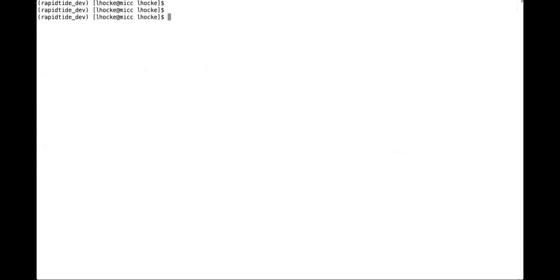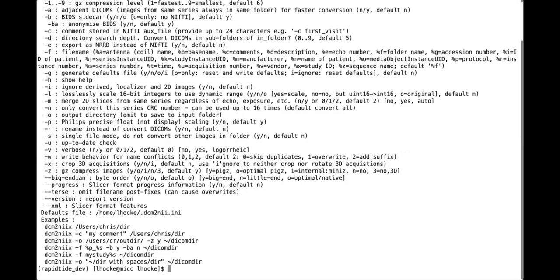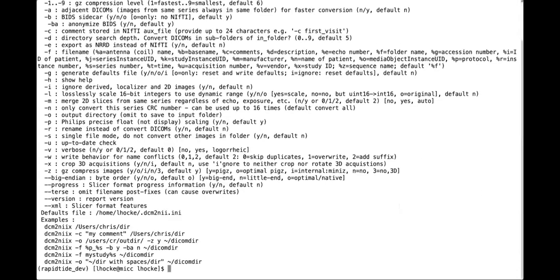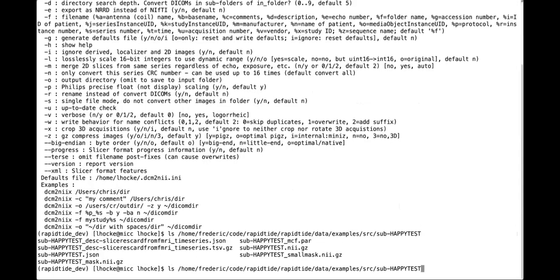If you wonder how to get to that data, you normally just have any DICOM files, and if you do dcm2niix, you will directly get the JSON file as well as the NIFTI file, and everything you need will be stored in there to run HAPPY. So don't process your data, that's very important, and just use the NIFTI and the JSON in the beginning.